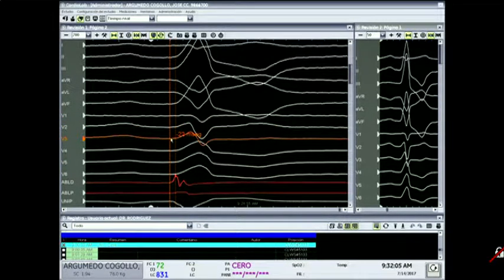We have not completed the map fully, but I would like to ask the audience, and you, Luis, do you think that this is a good application site, or will you go back to the right side? Which would be your strategy at this point? I would like to hear the opinion from the audience. Would you apply here? Would you map more?